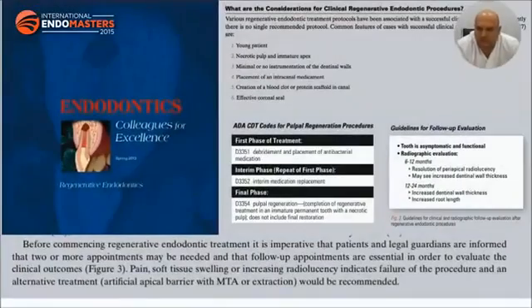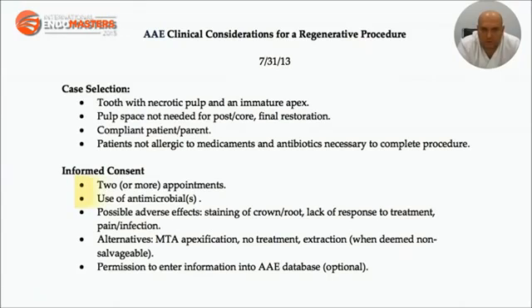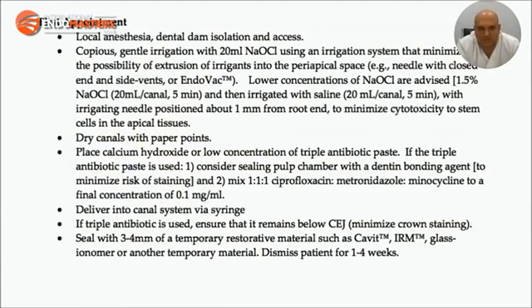Recently, the American Association of Endodontists, Colleagues for Excellence, published a recommendation about regenerative endodontic procedures, a guideline about the follow-up evaluation based on the common features of cases with successful outcomes, like the cases that I shared with you. According to the American Association of Endodontists, 2 or more appointments are needed, and the use of antimicrobial dressing, calcium hydroxide or antibiotic mix. They are not suggesting single-step revascularization procedures like my cases. Maybe in the future they will change their recommendation, but this is how it is right now.